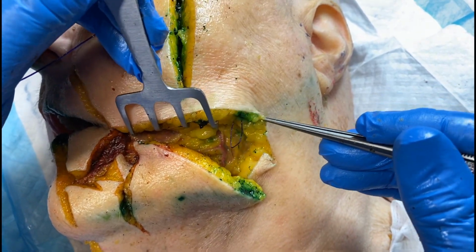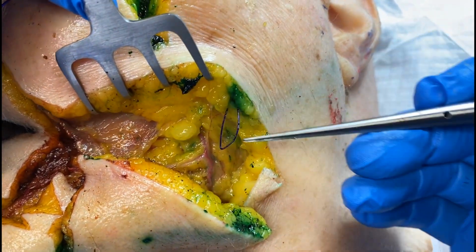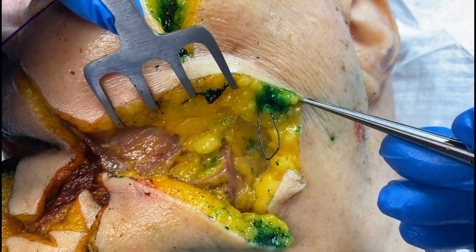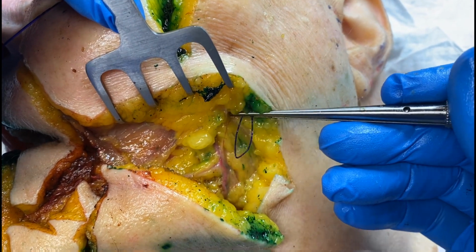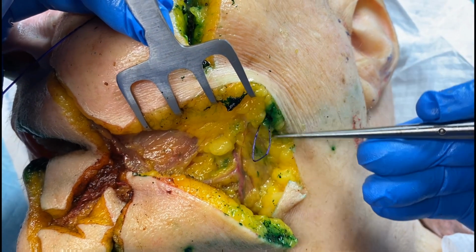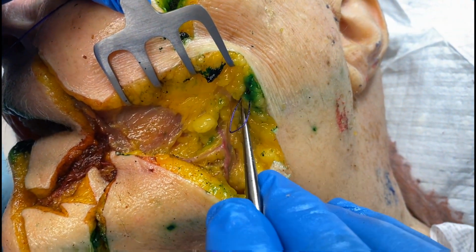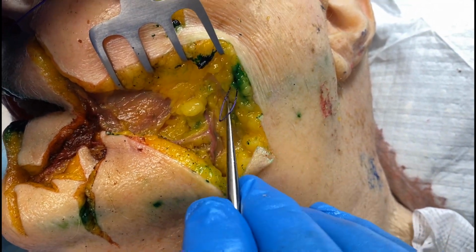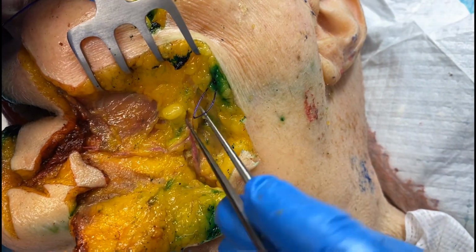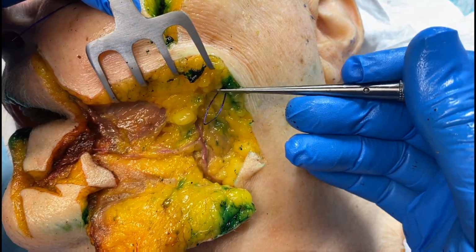But take a look at this thread and take us through the different layers here and what we're taking a look at. So this thread is in the correct plane. So we are in the fat of this area. So we have our skin and our dermis, and this is our superficial fat pad. It's real globular. And then below that is where all of our muscles are and all of our vasculature. So we're in a very safe plane. Our vessels are below it, our muscles are below it, and this is just the fat.